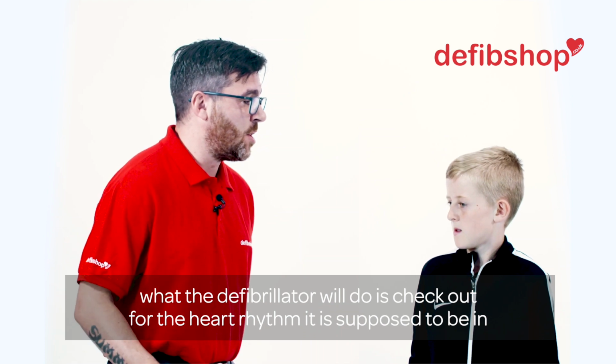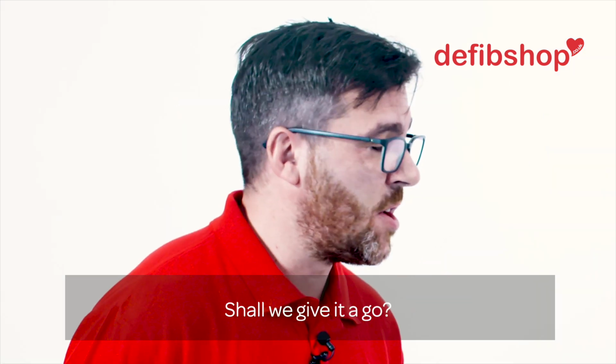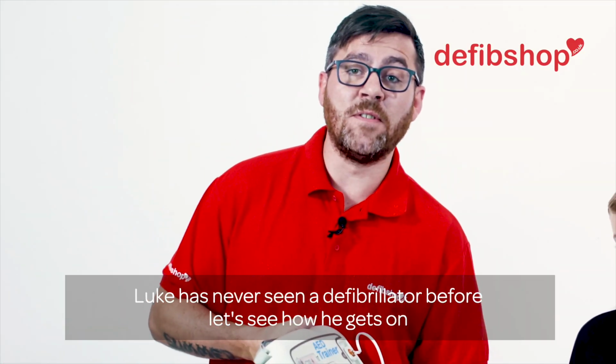What a defibrillator will do is check out for the heart rhythm it's supposed to be in. If it's in a shockable rhythm, it'll deliver a shock. If not, then it won't. Should we give it a go? For this next part, we're just going to follow Luke and his interaction with the defibrillator. Luke has never seen a defibrillator before. Let's see how he gets on.